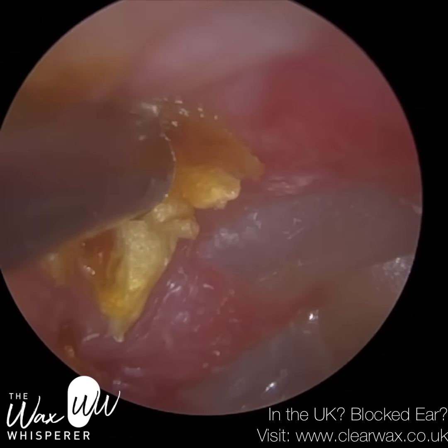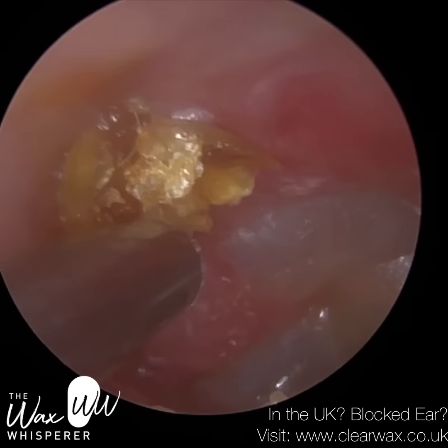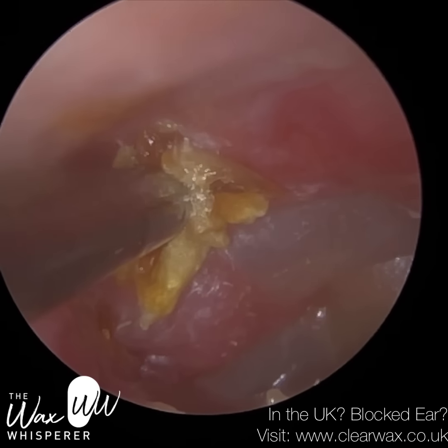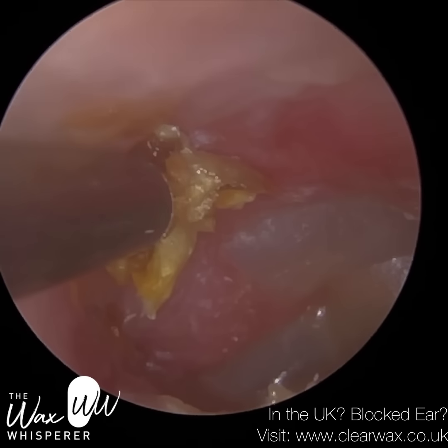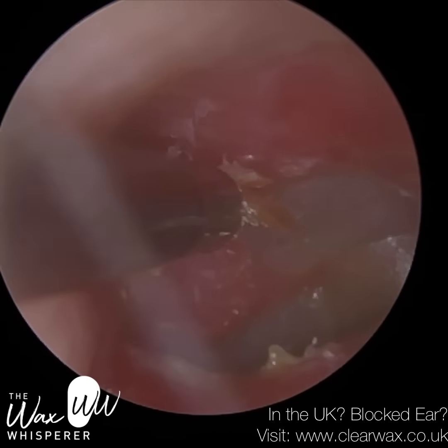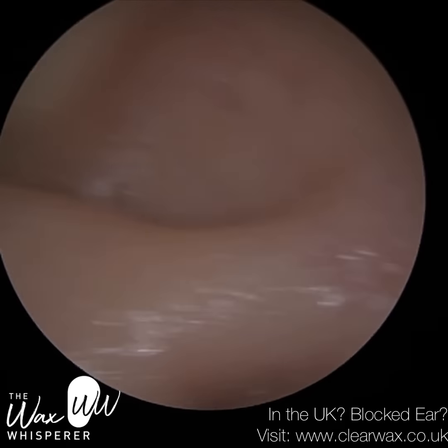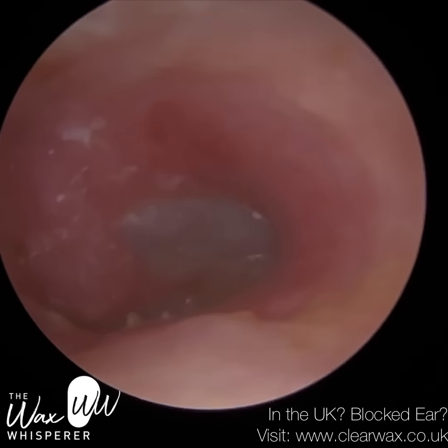But also I wanted to see how wide this ear canal was in this region. So they didn't have a cholesteatoma. This is not a cholesteatoma, but it could be one behind that. We don't know. So I wanted to remove it for diagnostic purposes. And you can see there's no cholesteatoma there. But it gives me a better perspective of how wide that part of the ear canal is. So go in.